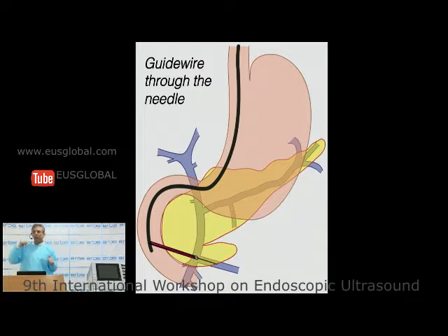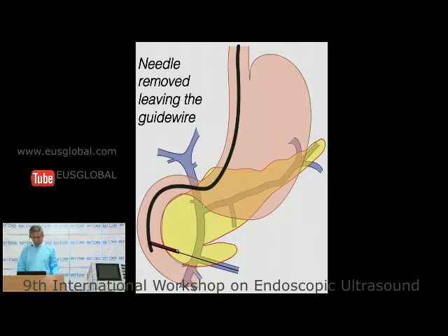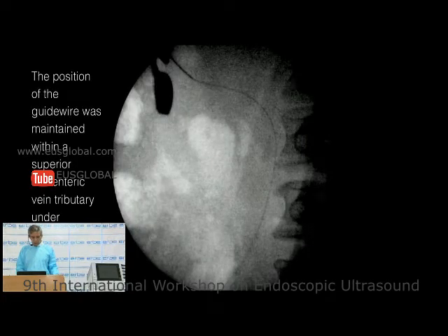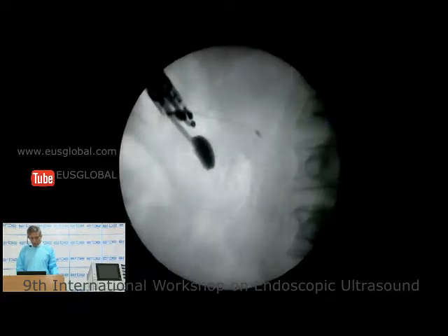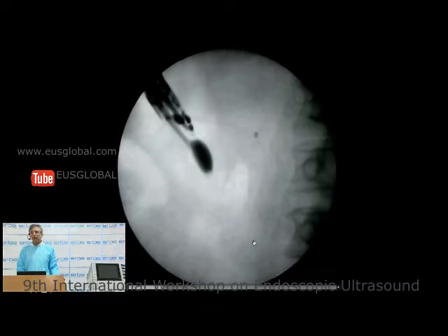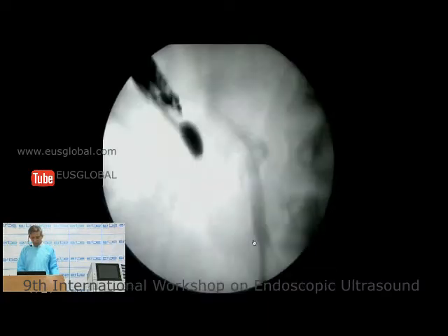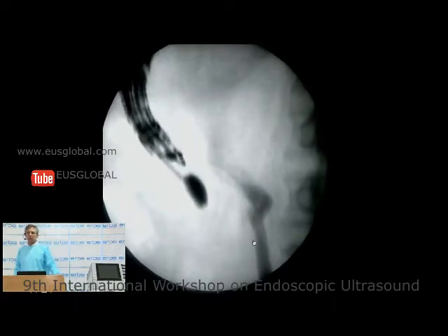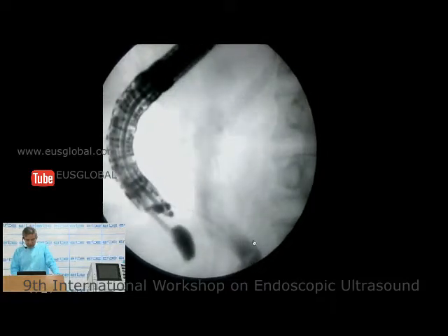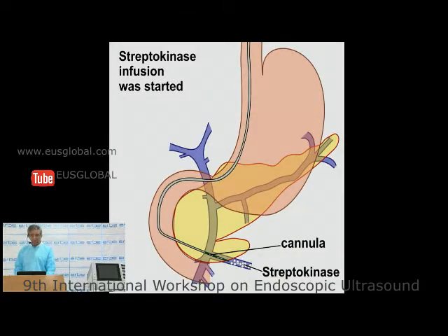The endoscopic ultrasound-guided puncture of the mesenteric vein was done, a guide wire was placed in one of the tributaries of the mesenteric vein, and then we started cannulation. We put in a cannula over the guide wire and this cannula was advanced into the mesenteric vein, and then the thrombolysis was started.